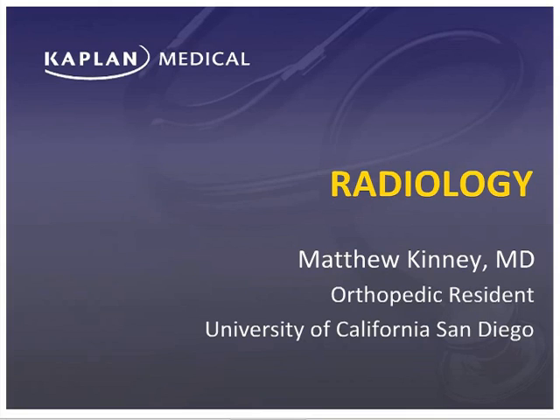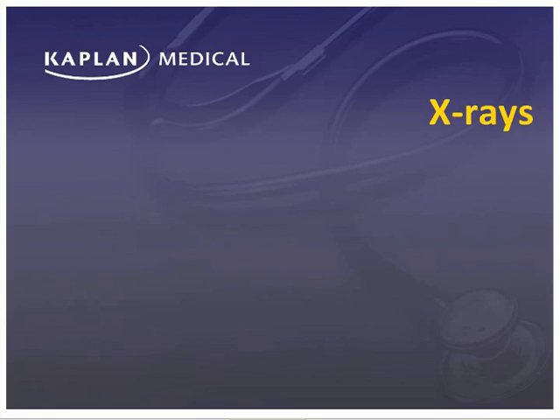Step 2 CK exam. In this first lecture, we will review the various different types of X-rays you can expect to see at some point on your exam, and will then shift focus to the advanced imaging modalities in the next 2 sessions. Without a doubt, X-ray is by far the most commonly ordered imaging study, and this is reflected on the exam with the presence of lots of X-ray images accompanying the question stems. Knowledge and understanding of these images is guaranteed to help you correctly answer many questions on Step 2 CK. Let's start by discussing chest X-rays.